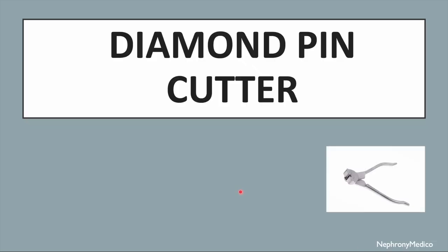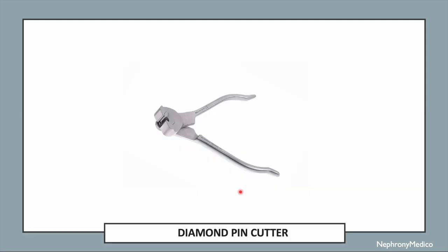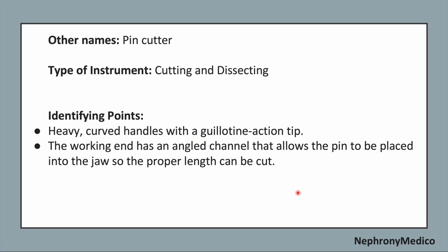Let's talk about diamond pin cutter. This is a picture showing diamond pin cutter. Now, the other name of this instrument is pin cutter. It is a cutting and dissecting type of instrument. Now, identifying points. It is a heavy, curved handled instrument with a guillotine action tip.